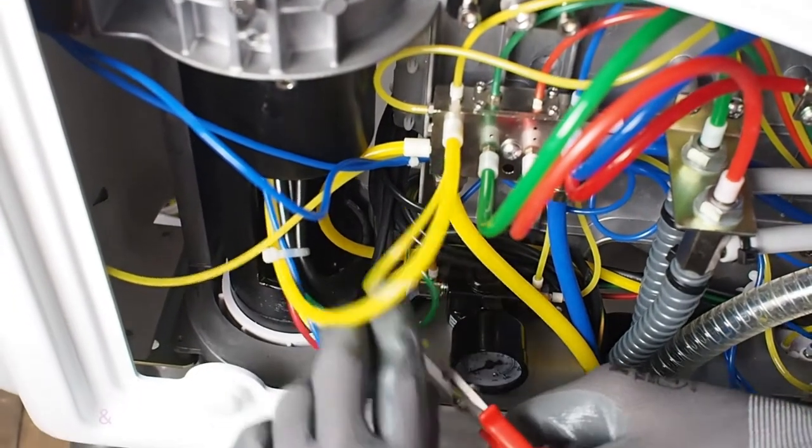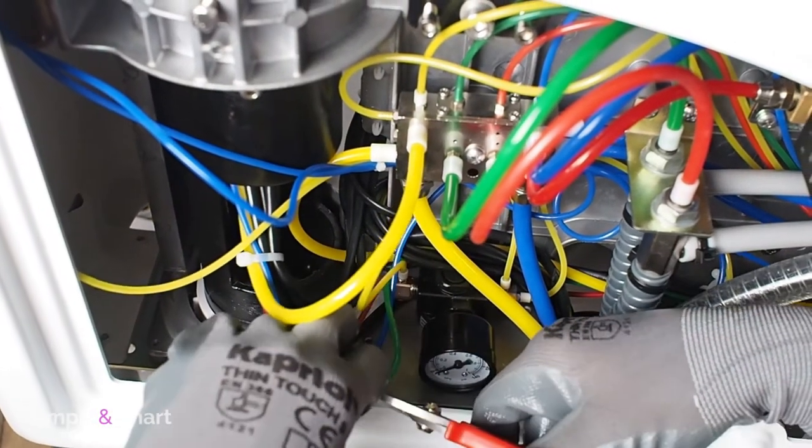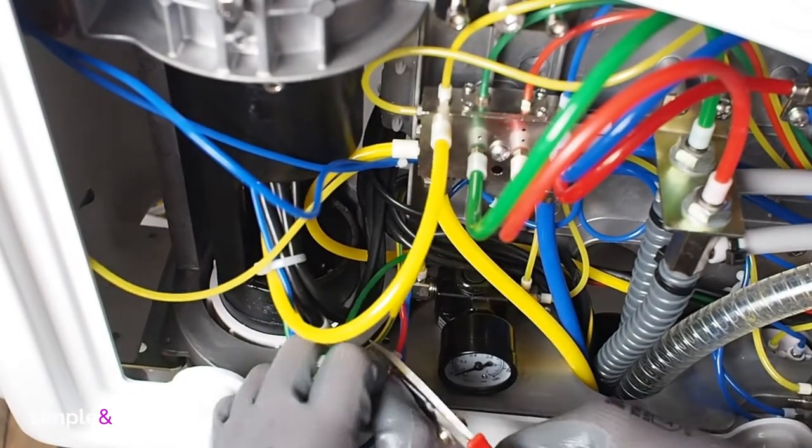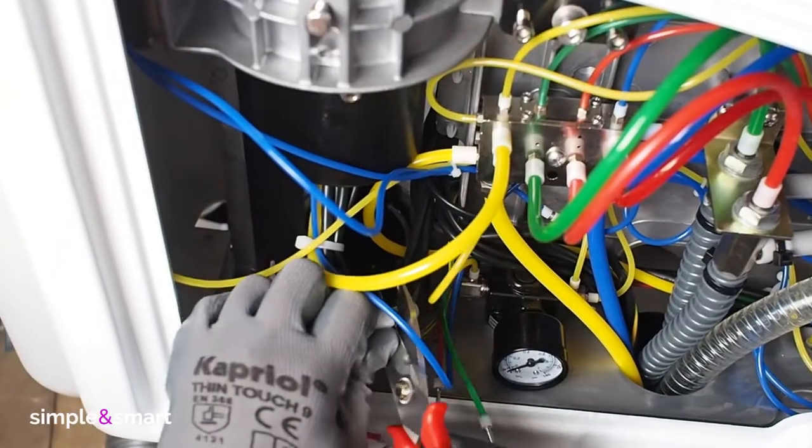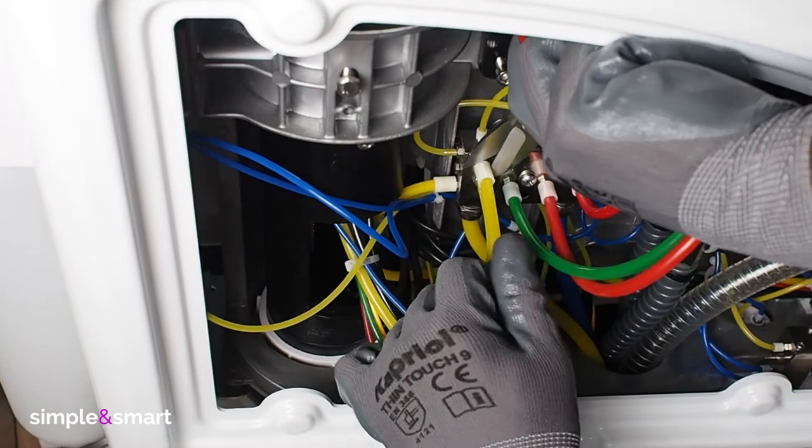All tubes and wires coming from the instrument tray must be disconnected. Start from the small tubes where they have junction. Disconnect the small green one, the red one, the blue one, the big black one, the yellow one on the metal separator.